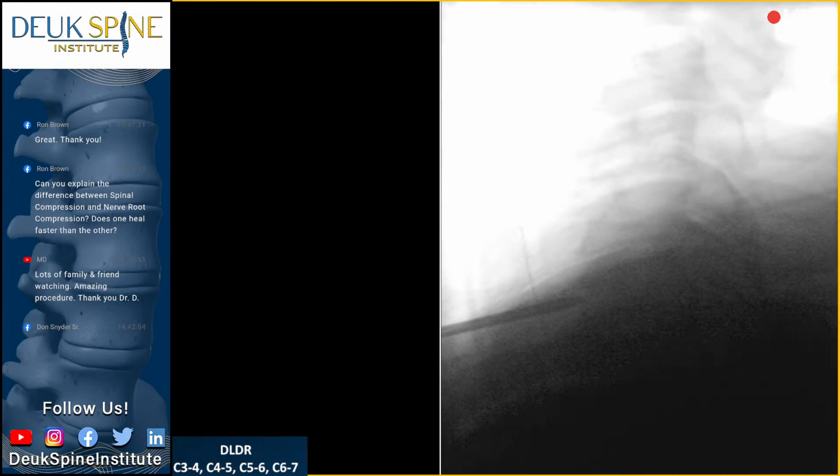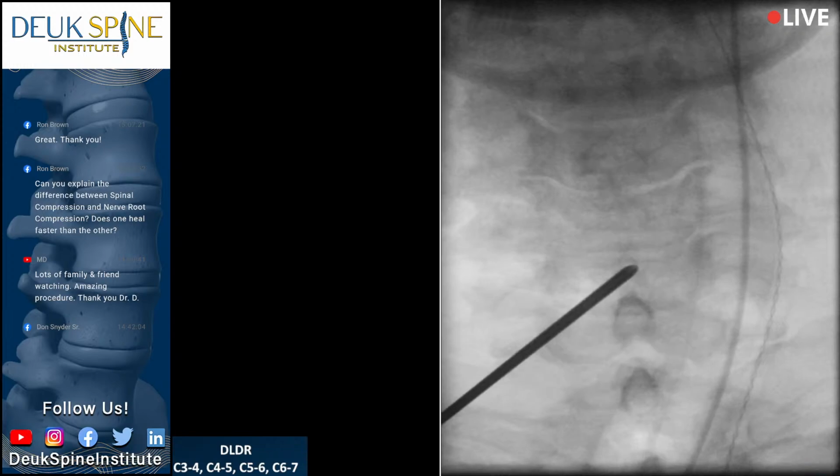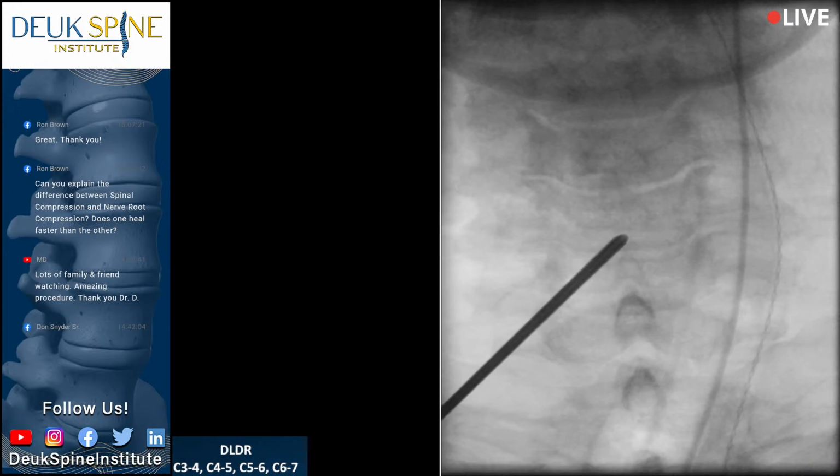AP. Nobody has to do anything right now. You guys can all relax a little bit. I just need to check the AP view. Wow, pretty good. Shot. Shot. Hold on. Shot. All right, lateral.